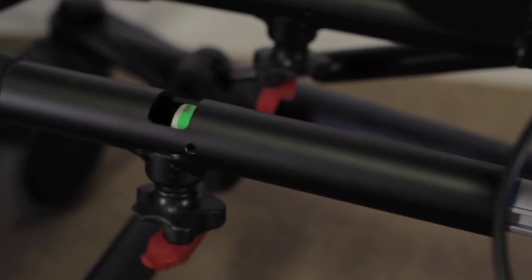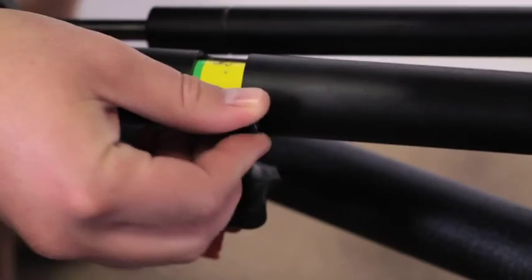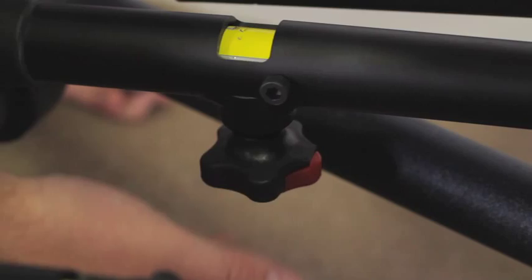Insert both following arms onto the unit until the yellow color setting is reached on both following arms. Place the screws back onto each following arm, making sure the following arms remain in the yellow setting and both tubes are lined up. Tighten securely. Flip the red tabs closed and tighten knobs securely.